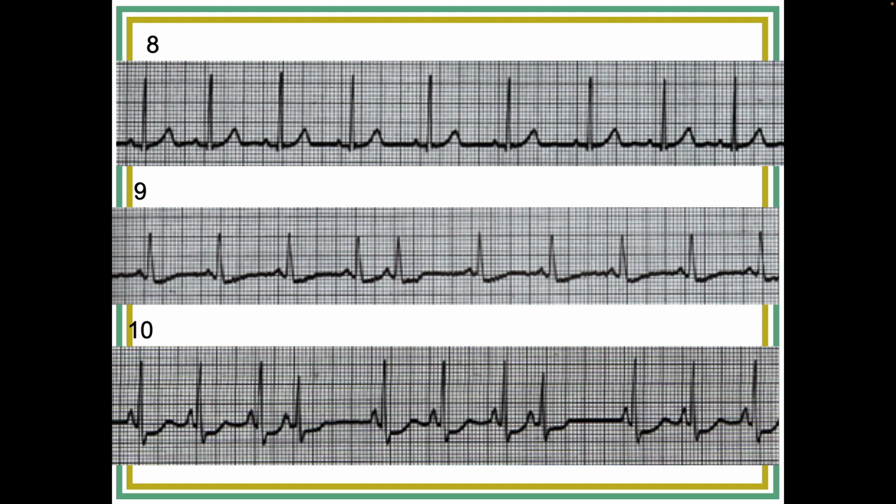There's that one, and then there's another one. Where's the other one? Looks like right there. Okay, now, characteristic of a premature beat, we've already talked about the fact that it comes in prematurely, meaning that the R to R here is short. But there's another characteristic of a premature beat: it's followed by an R to R interval that's too long.